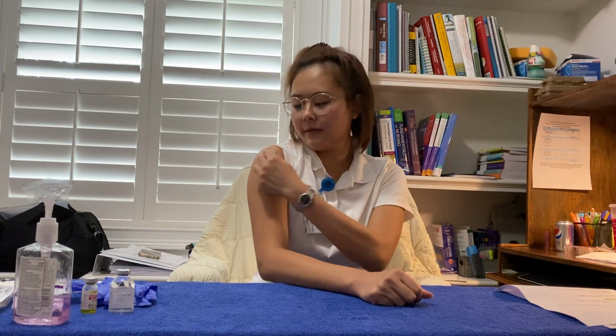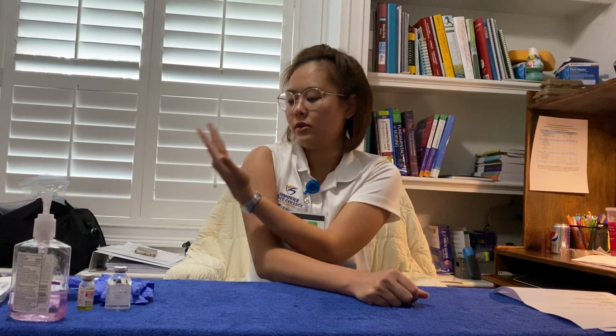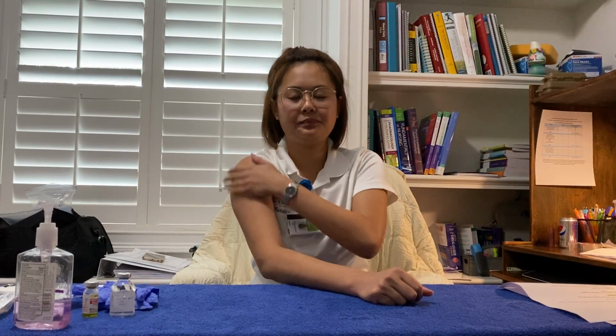You're going to find the acromion process right here, and then you're going to put 2 to 3 fingers down, depending on how big your fingers are, and then you're going to find a muscle right here, little juicy right here, and then your injection is going to go right here. When you give your injection, you're going to use your hand and pull the skin outward, and then your injection is going to go right here. We're going to use the Z-track technique on this one.